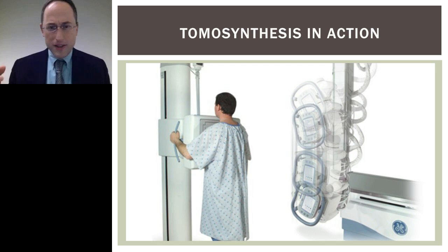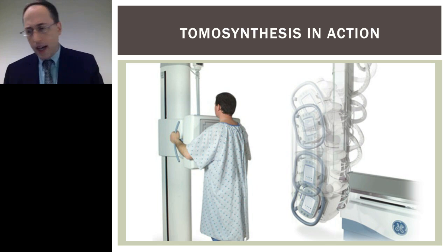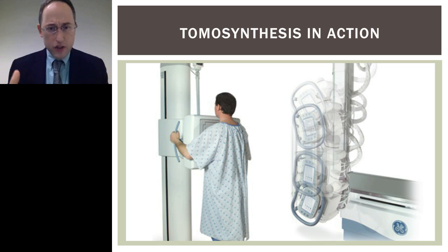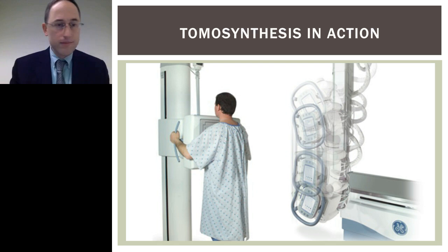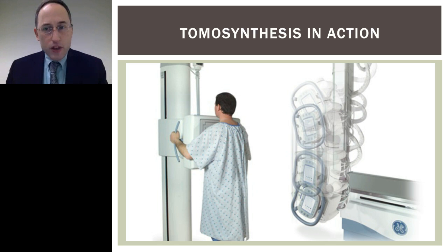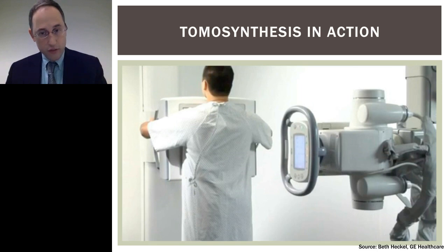You know, you can't have a patient stand in the CT scanner. And then you're not just confined to chest. You can actually do tomosynthesis of any body part, although I will be talking about chest applications as we go through this. So now I'm going to show you a video of an actual tomosynthesis instrument acquiring those projections, the ones that are used. Okay, so here's this video.